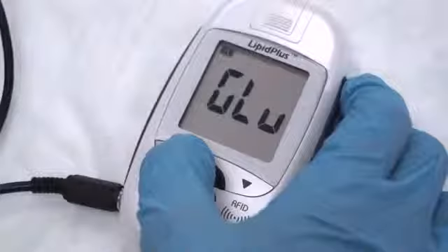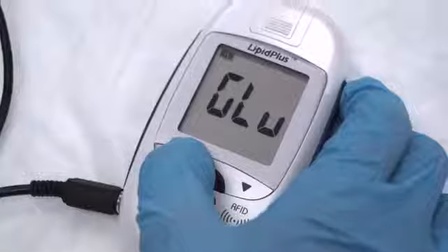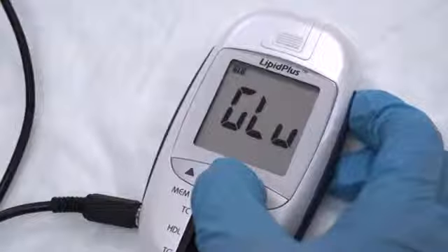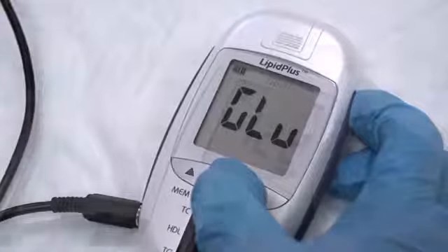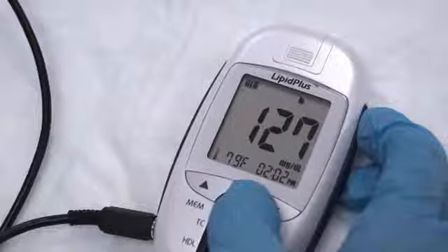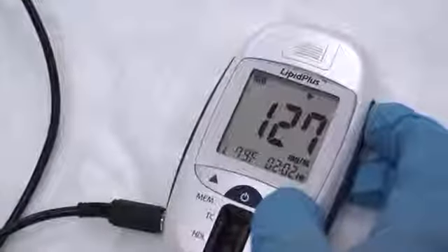Lipid profile or glucose test results can be retrieved by pressing the up arrow button while the analyzer is in standby mode. Press the up arrow button to select either the lipid panel or glucose test results. Then push the mode button to review the results. By pushing the up or down arrow buttons, you can scroll through and review previous results. Specific results can be printed by pressing the down button for 3 seconds.